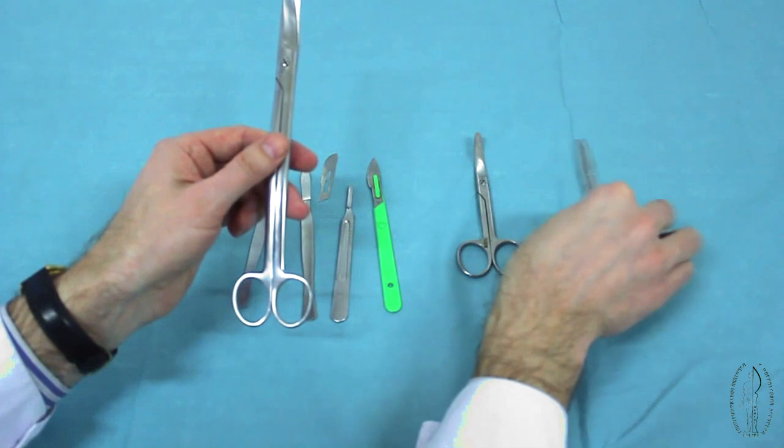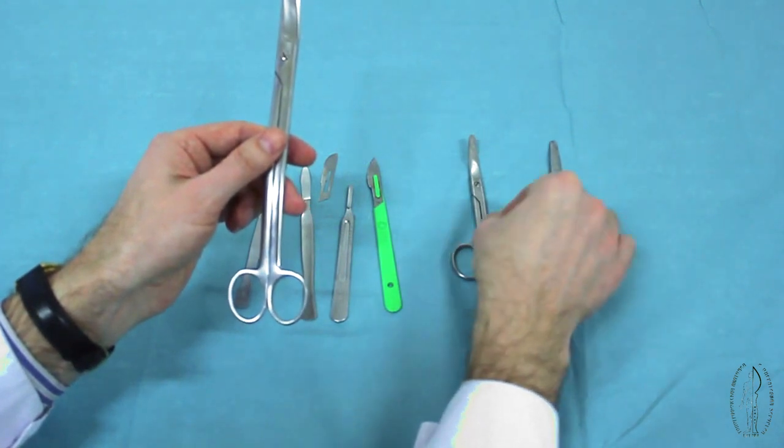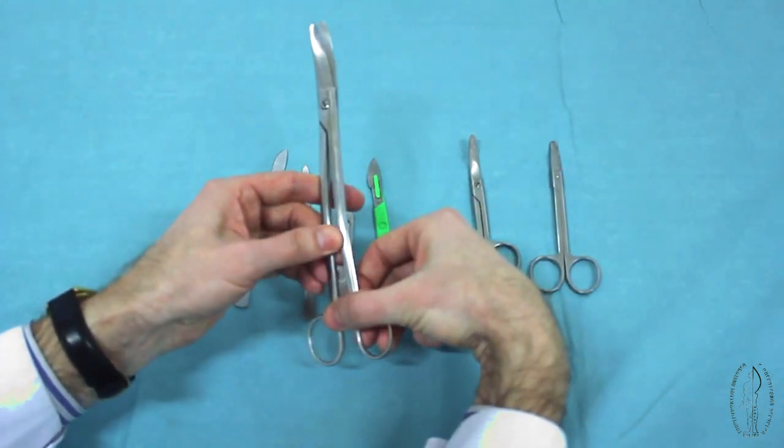Surgical scissors are long or short, straight or curved, blunt or pointed.